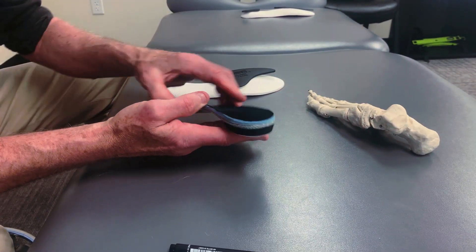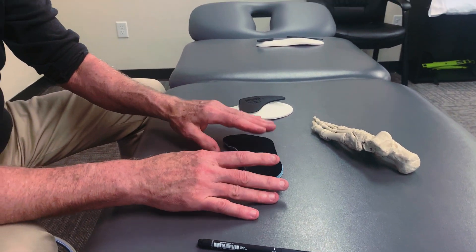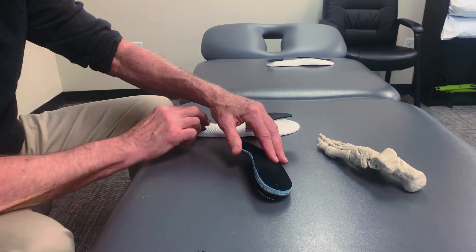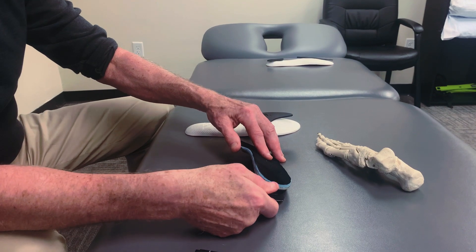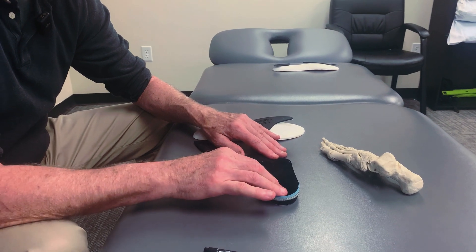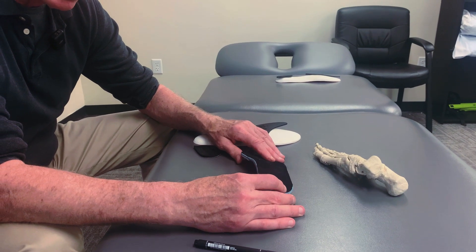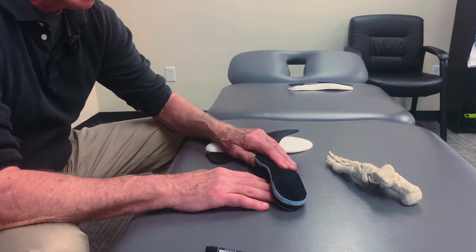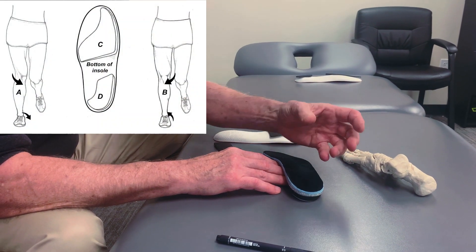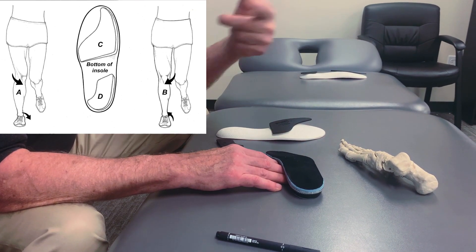Different researchers have done studies where they took conventional orthotics that were just flat insoles and measured three-dimensional lower extremity motion, then did the same thing after adding a varus post, which tilts the entire orthotic. There are two components to an orthotic: the arch support component — which research is showing may not necessarily be the best thing — and the varus or valgus post component. These are angled wedges. When you put an angled wedge under someone's foot, it decelerates the velocity of foot pronation, decelerates the degree the tibia turns in, and the degree the knee and hip turn in. It also alters stress in the knee.